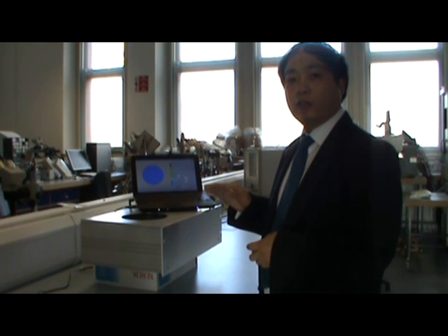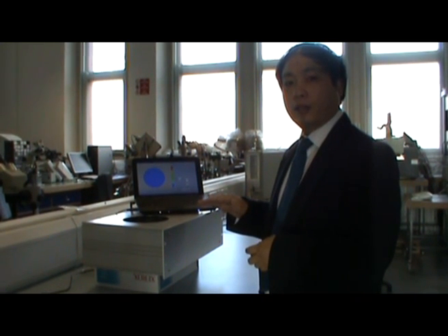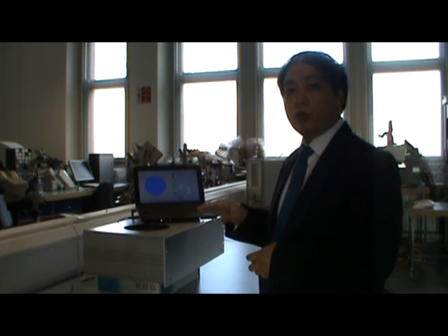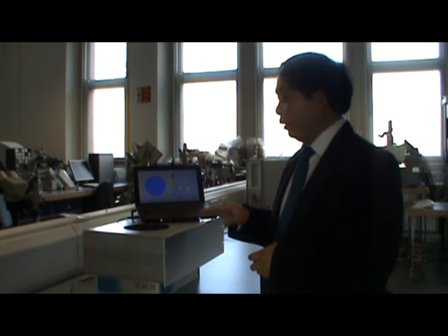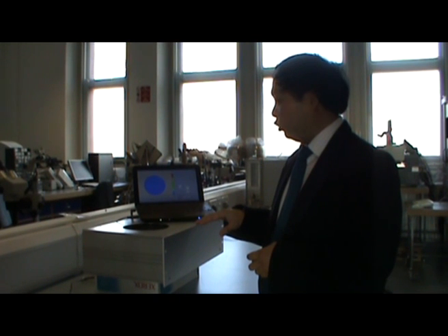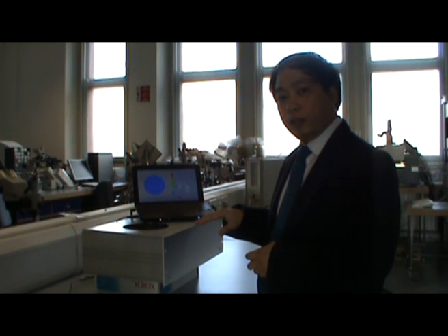This is the radio frequency breast scanner. It uses radio waves to produce tomographic images of a breast. What you see here is a prototype that we have for breast scanning. The electronics are housed in this box, and the scanner has got a breast-shaped imaging unit.